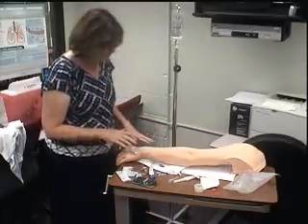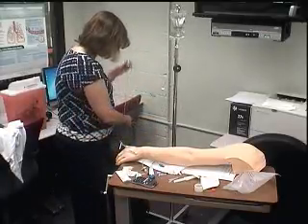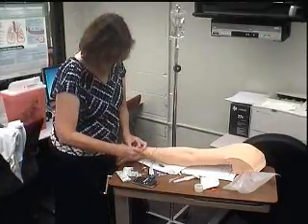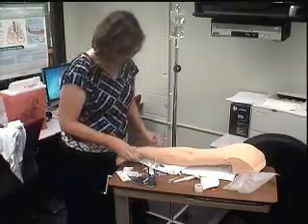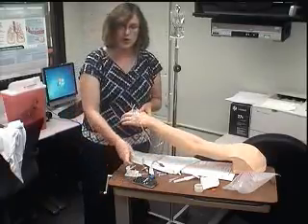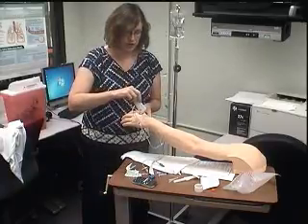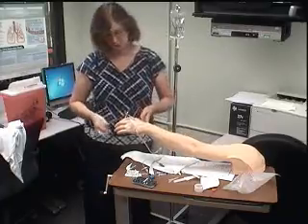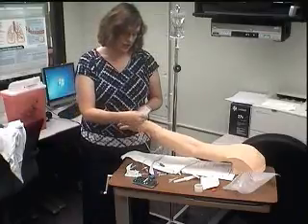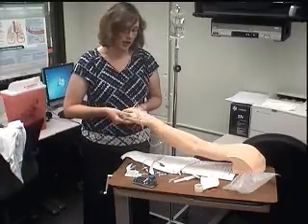All right, so that is going to be your checkout. So this would be hooked up to the patient by the time it's done. Now, part of the checkout is after it's inserted, we would say, okay, what are you going to chart? So I would chart that I inserted a 20 gauge IV catheter, saline lock, into, where did I put it? Actually, yeah, their left hand. How many attempts did it take? 1 attempt. Patient tolerated well. Then I hooked up saline at 75 mils per hour.